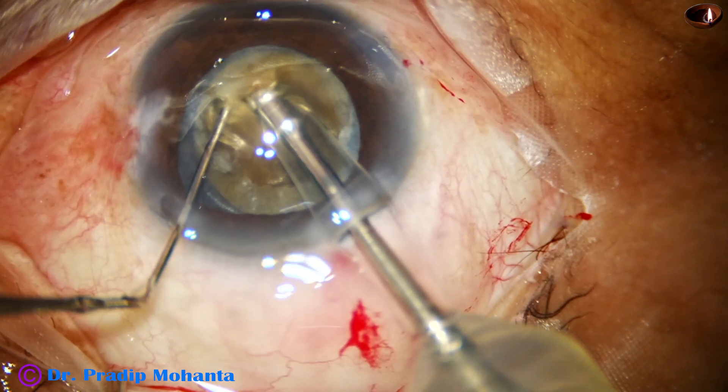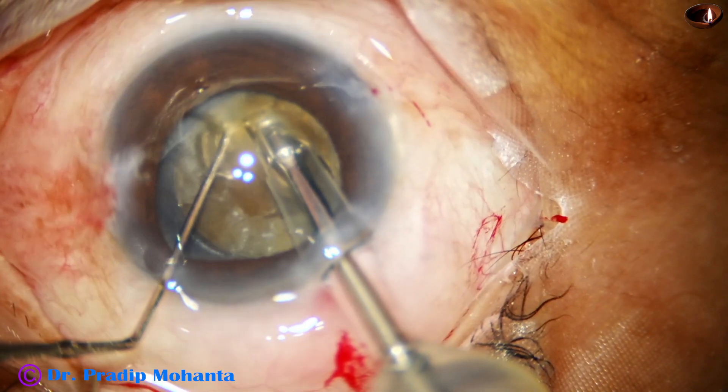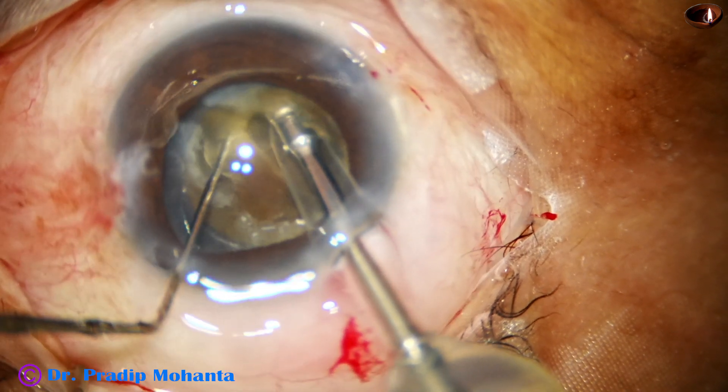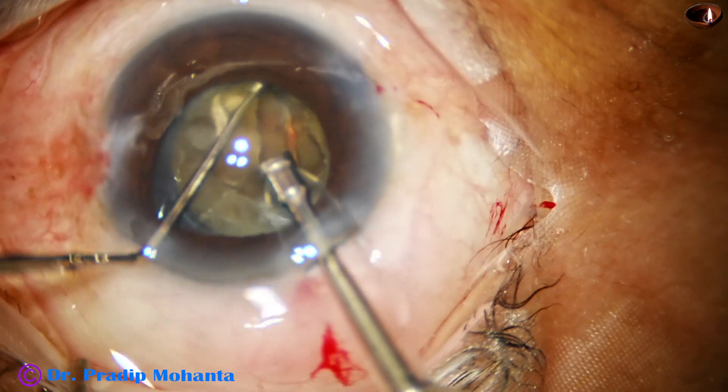I find that I am not getting the crack easily — it's a very leathery kind of nucleus. Ultimately, I got a crack.